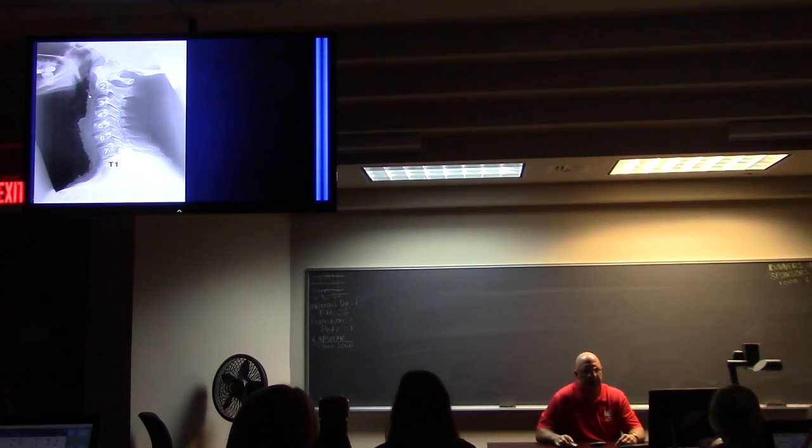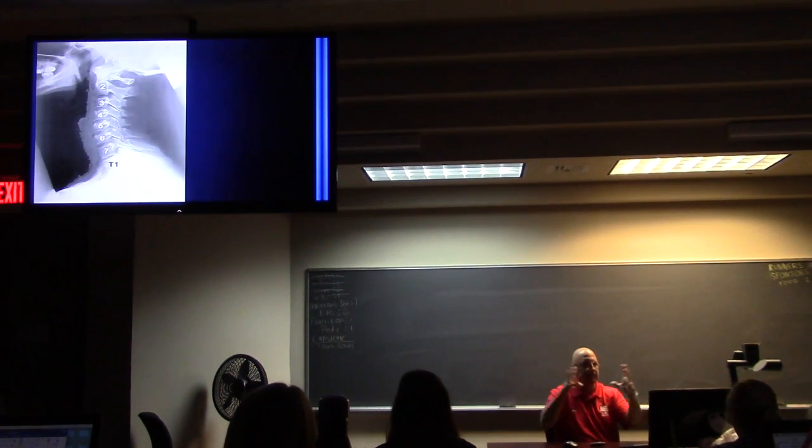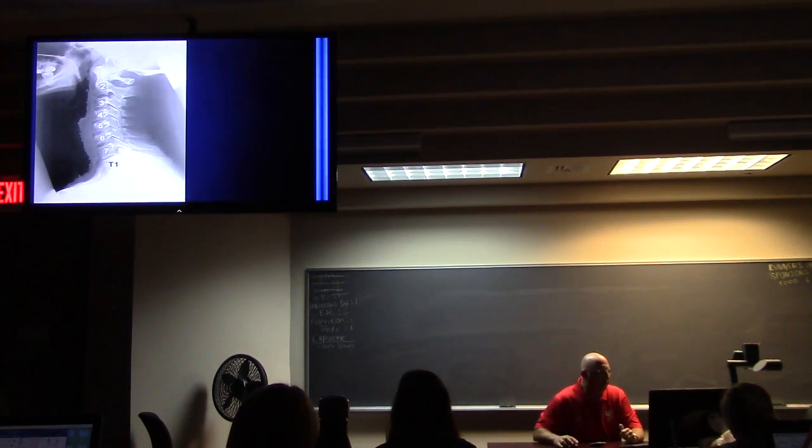I don't carry a ruler with me, you don't carry a ruler with you, and we're talking about digital x-rays. They can zoom it up and zoom it down. A good rule of thumb is the soft tissue from here to here should be less than 5, or less than an intervertebral disc space. So it should be smaller than the space between 2 to 3. Got it? One other soft tissue we're going to look at is the C5.